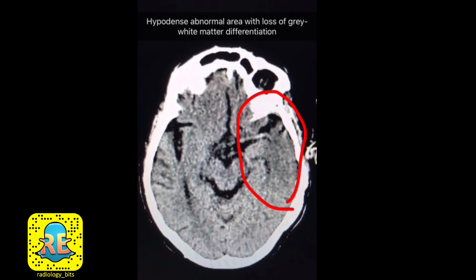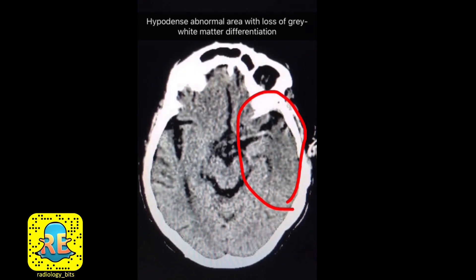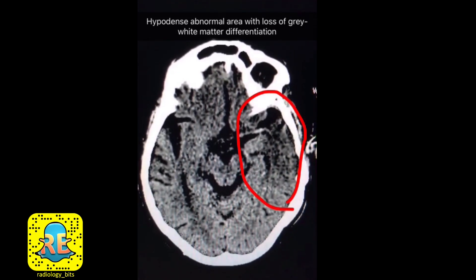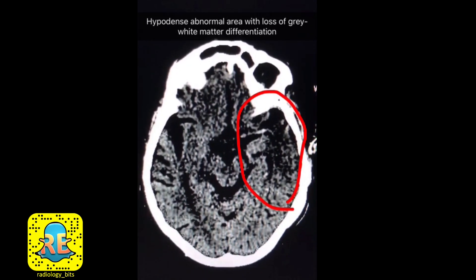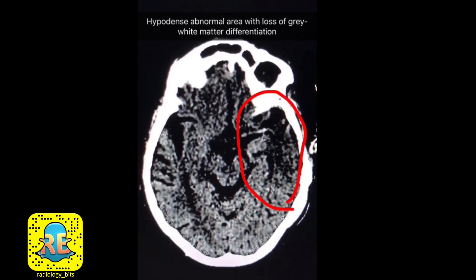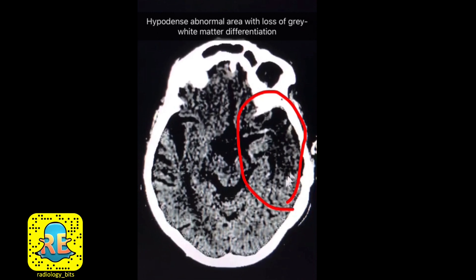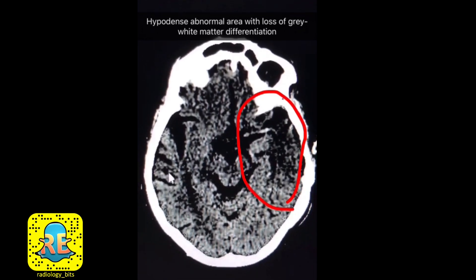To emphasize the previous point and see this hypodense area better, let's change to a darker window. Although it looks noisy, you can easily identify the very obvious hypodensity in the left temporal lobe compared to the well-differentiated gray and white matter on the right side.